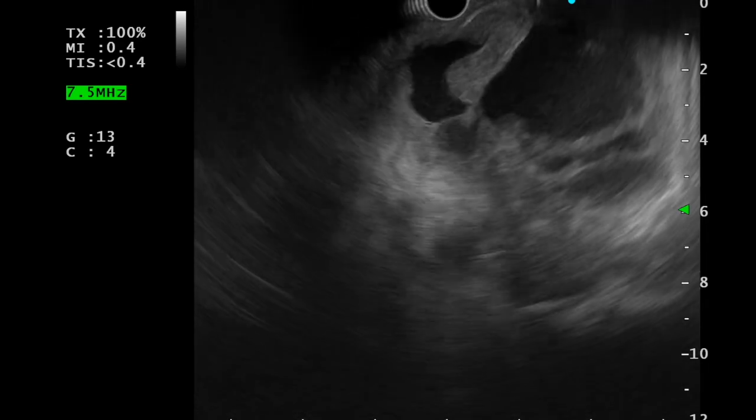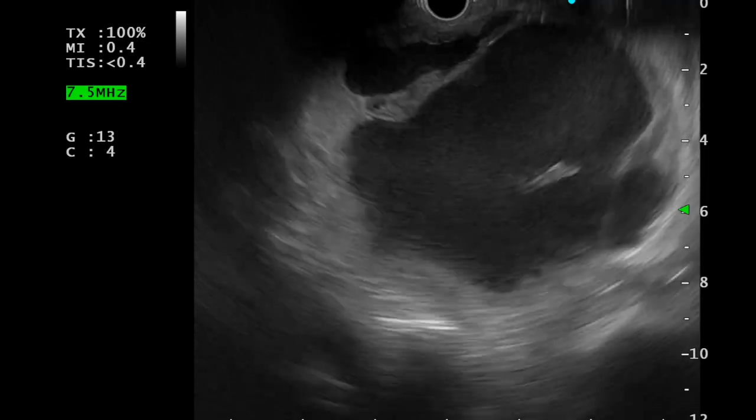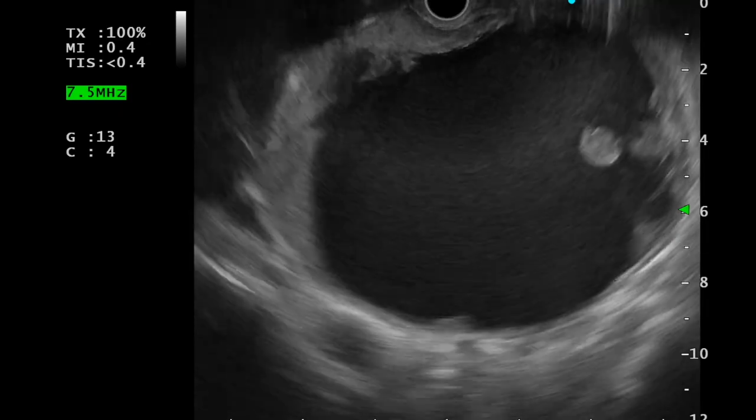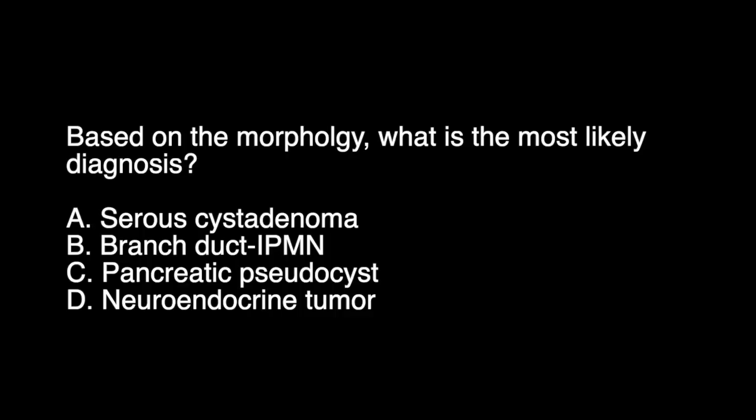The cyst was multiloculated. Based on the morphology of the cyst, what is the most likely diagnosis?